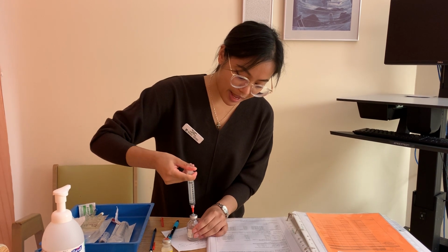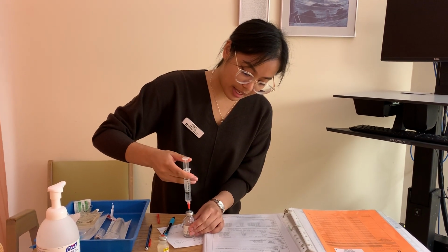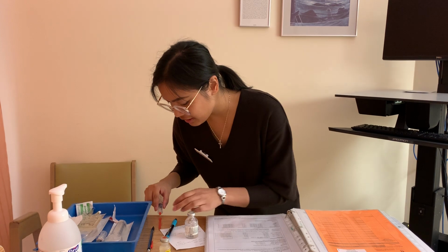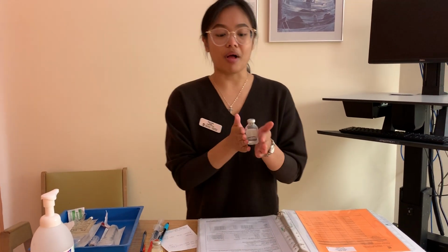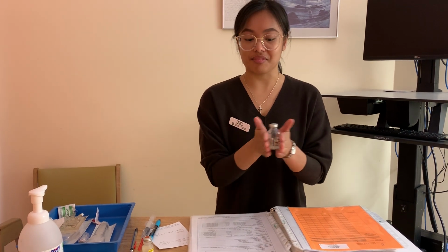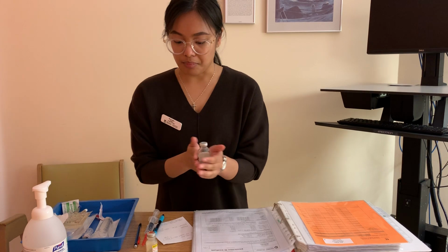And I'm going to let the air rise from my syringe so I can have that pressure back from that vial. And to ensure I'm not losing any more medication, I'm going to recap again, scoop method. And I'm going to mix the medication between my palms to ensure that the medication has been mixed accurately and I'm not drawing up any air bubbles. I'm also not shaking, to ensure that it's not contaminated the top of my vial and the inside of my vial. So that's good. I've reconstituted that.